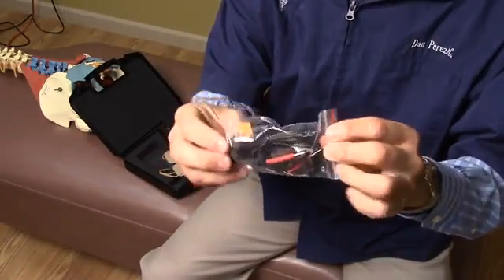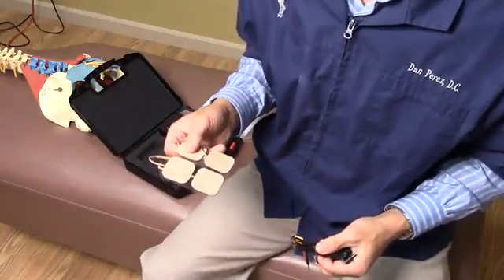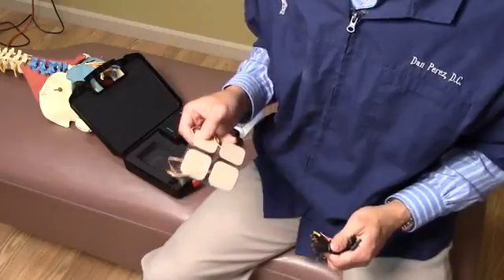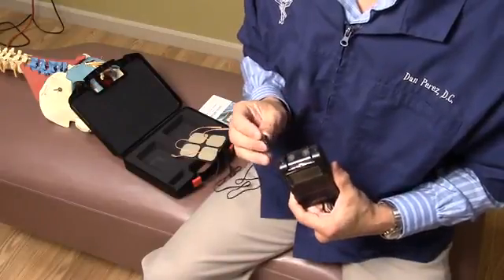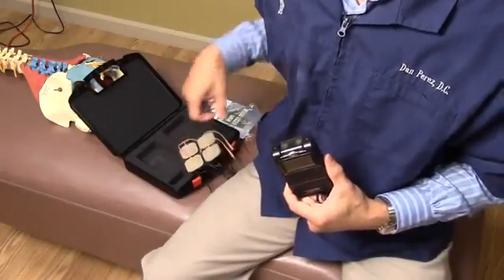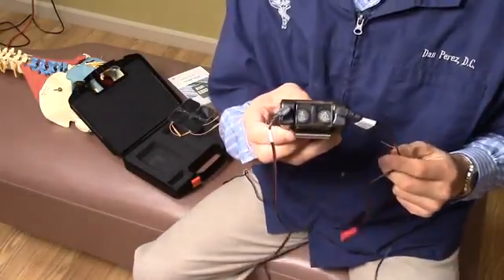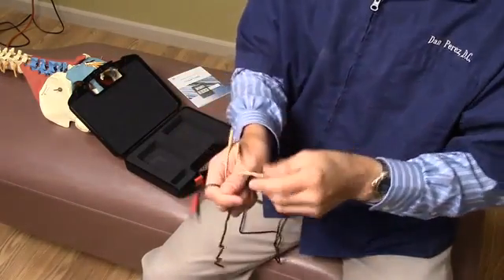Now these are the cables for the electrodes. You could use 4 electrodes around an area, or you could use 2 for one area and 2 for another area. For example, you could put 2 in your low back, and if you have also right shoulder pain, you could put the other 2 on the right shoulder. It's very important to not turn on the TENS unit until everything is all set, because if the power is on and you touch these electrodes with your fingers, you will get a shock. So wait until these electrodes are applied, and then at that point you could turn it on. You'll notice I attached the leads, the left channel and the right channel, into the TENS unit, and to each one we'll attach 1 electrode.